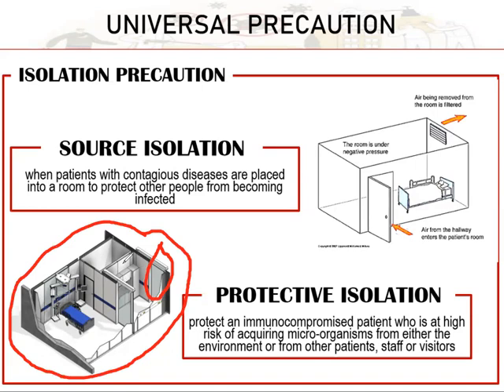So since magkuha man ta og dugo, we will bring our phlebotomy kit. But we cannot bring the entire phlebotomy kit in the presence of the patient. So we just have to bring unsa ato ang kailangan. So just bring our syringe, tourniquet, the cotton, unsa pa ba? The wet and dry cotton, the plaster, so just the things that we need during the extraction. After securing it, we can go inside this door where naa si patient. And we must perform blood extraction as fast as you can. Less than 1 minute dapat naka-perform na ka og blood extraction.